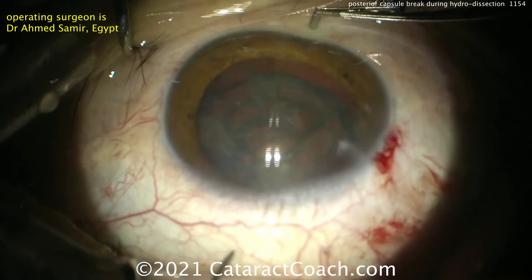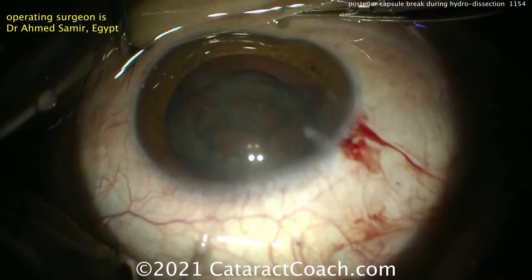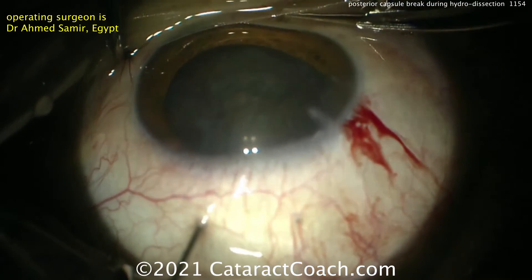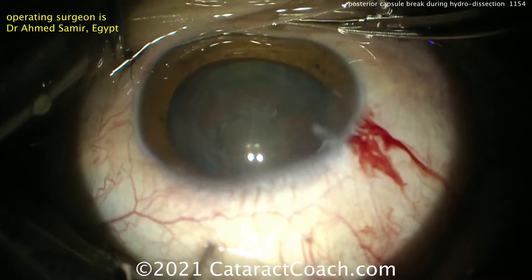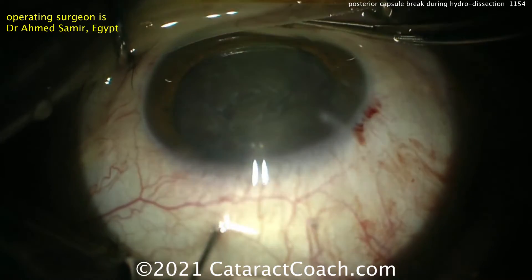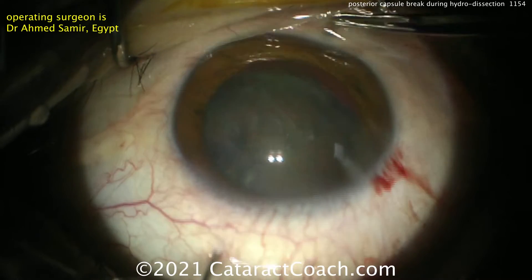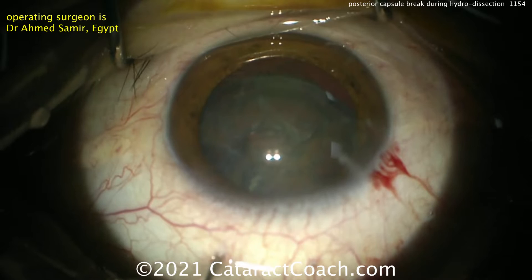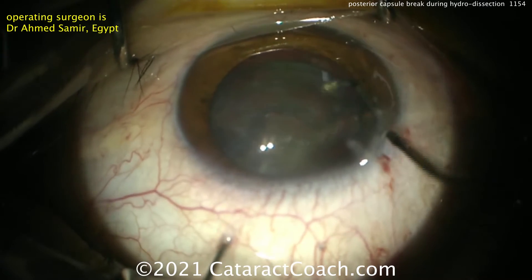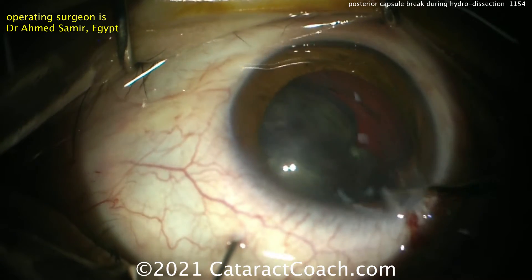Already the lens nucleus is falling down into the vitreous cavity. Now what he's going to do is something I do not advocate, but I want to show you — and in his hands it works. This is posterior-assisted levitation. A needle is going in through the pars plana in order to push that nucleus back up into the anterior segment, holding or pushing on that nucleus and supporting it. This is the PAL technique.